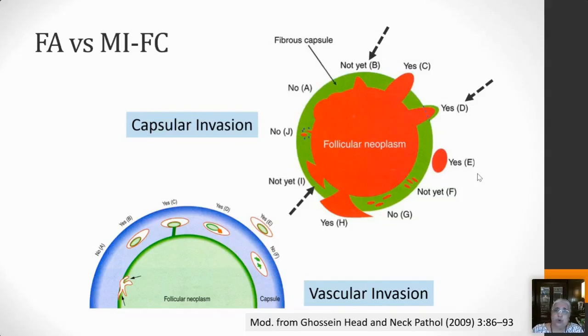But if you can show that these two look similar, what's within and without, yeah, all right, this is capsular invasion. But I'd just like you to look at this. Now, this has got a green zone beyond in D. If you look at D, it has a green zone beyond. And then you would say, but that's a capsule, and it hasn't actually invaded through that capsule.